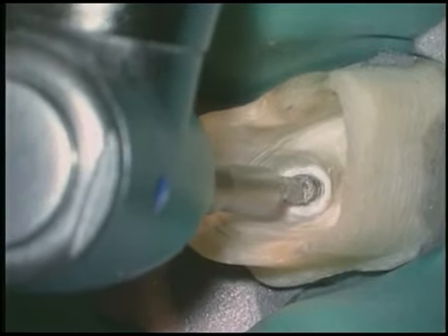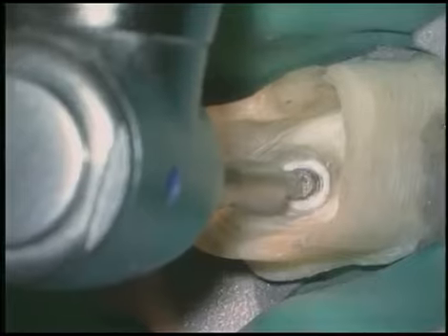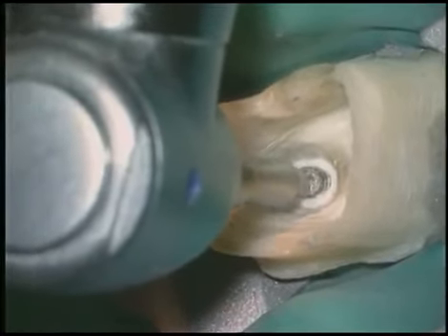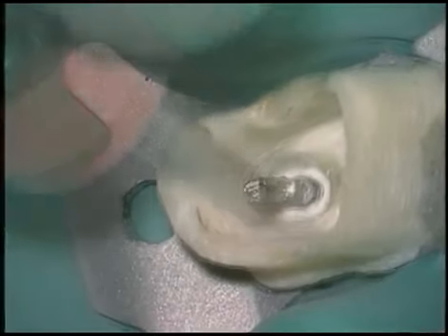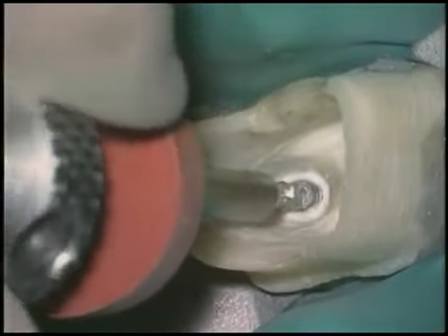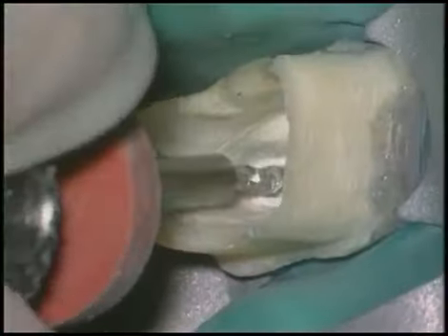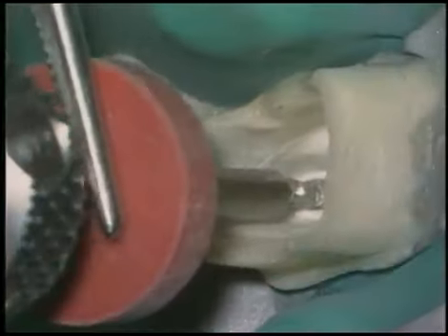The Cavo slow-speed electric handpiece can easily machine down a post with an appropriate trephine. Pumping action will allow the post to be machined down about 3 millimeters. Take the correspondingly sized tubular tap. Short little counterclockwise rotations begin to draw the tap down and securely engage it to the post. Now push the bumper down over the occlusal surface.